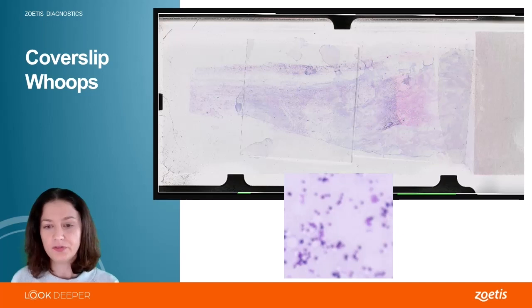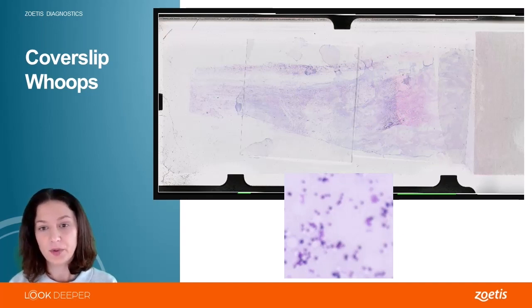Let's look at another example. This one, hopefully you can see it on your end too, but instead of using the one full slide length cover slip, what this sample actually has on it are two square, look like fecal cover slips that are squashed together. What the benefit of Imagyst is for me is that I can see the entire slide that you scanned. I can see the label, I can see the stage clips, which is what those three little hooks coming out are. I can see the full length of your slide. I can see the cover slip edges. I know where that is. And I can also see your scanned area.